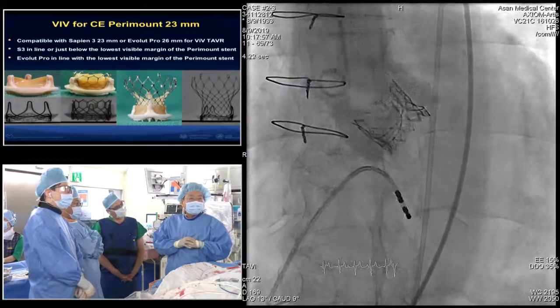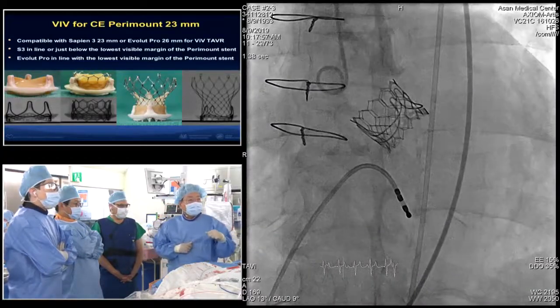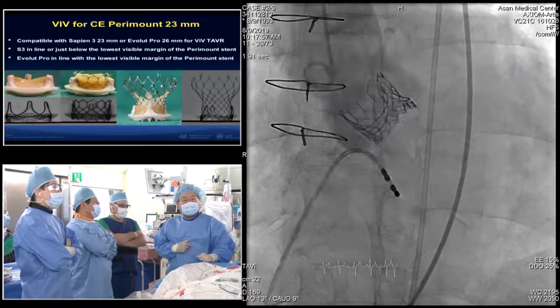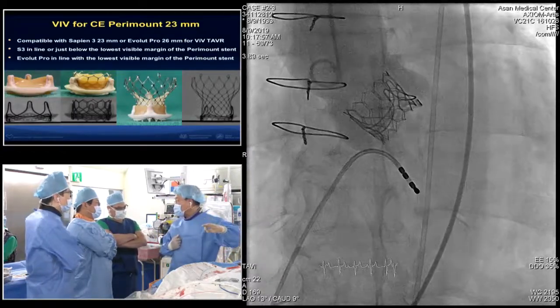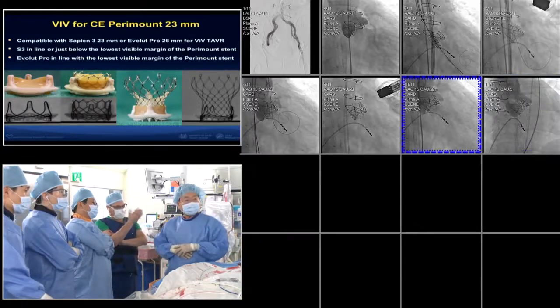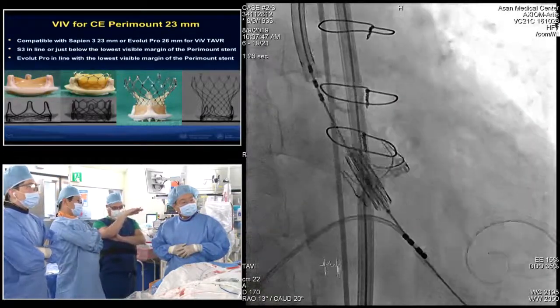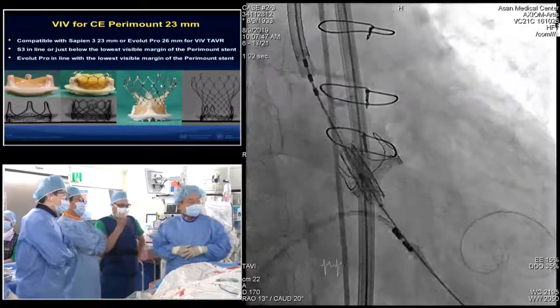What is your method for targeting the accurate position of the Sapien 3 in valve-in-valve? In some cases, there is some shortening. So how do you measure the accurate placement of the Sapien 3? David just mentioned the central balloon marker just above the rim. I think the easiest way with an S3 is to know the height of the expanded S3 and compare that to the height of the surgical valve. Exactly. And then you can determine the top, because when you expand an S3 valve, the top pretty much stays fixed. So if you position the top correctly, then you know the bottom from the height. That's probably the most reliable way.